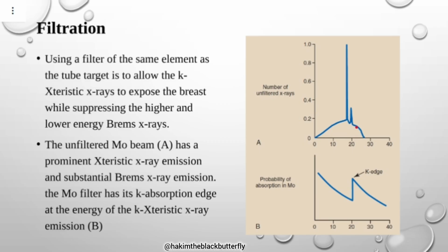You're making the breast to be of a uniform thickness such that you can have a uniform exposure all throughout the breast. The nipple is a problem. When vigorously compressed, the tissue is brought closer to the image receptor and the focal spot blur is reduced.